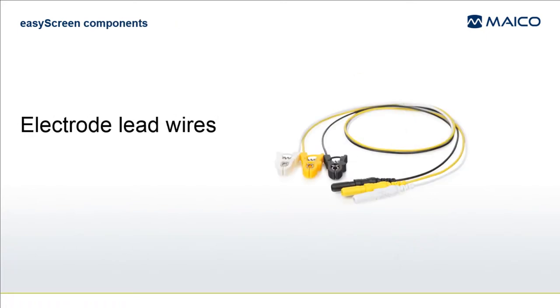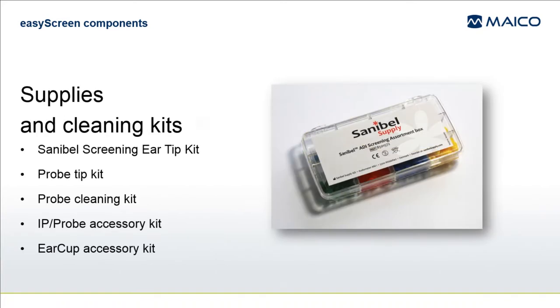ABR electrode lead wires will be included with the system. Depending on the system configuration you purchased, various supplies and cleaning kits will be included.